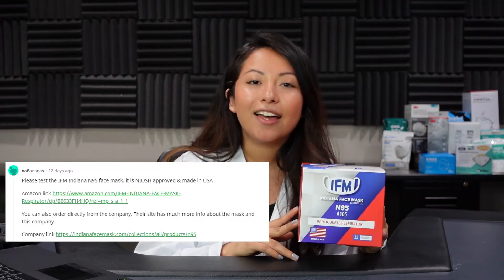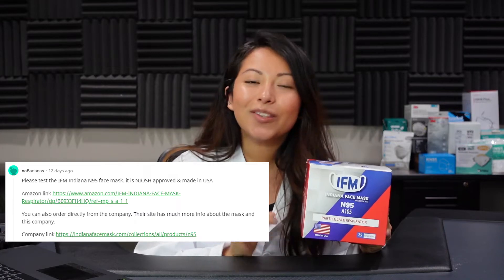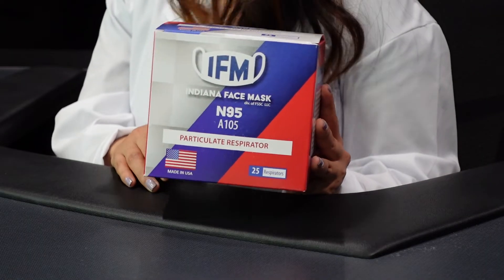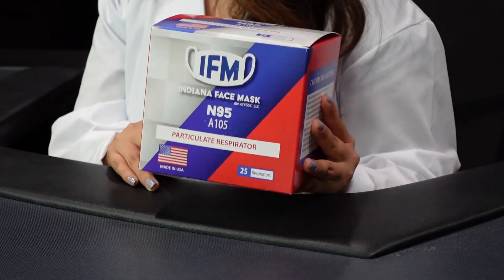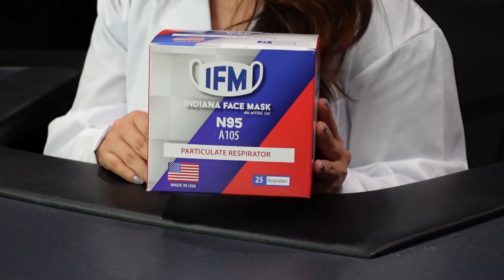Today we're going to be reviewing the IFM Indiana face mask. This is our first request video and we're really excited to be testing this face mask because it is also made in the U.S., similar to the BNX that we proudly distribute. Let's go over the listing before we open the box up.